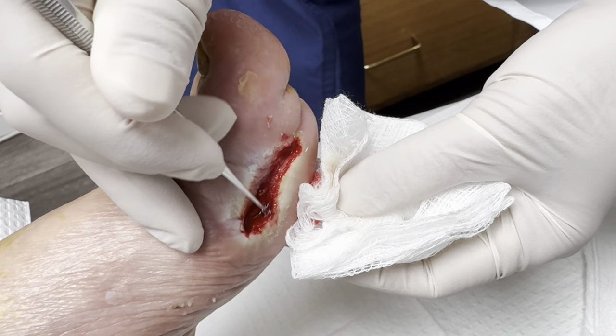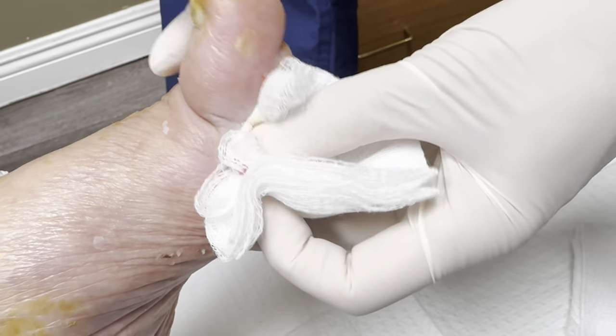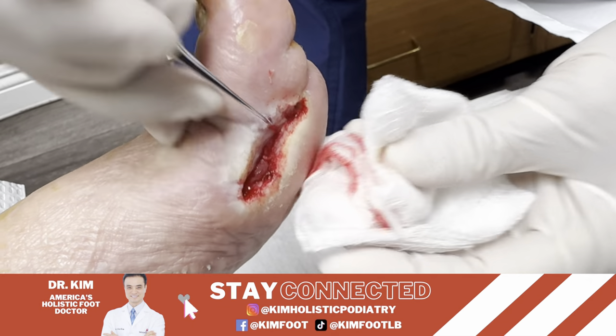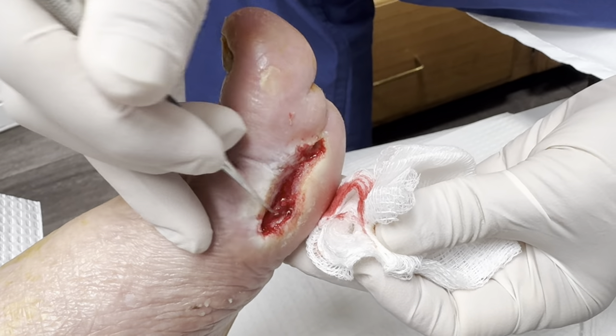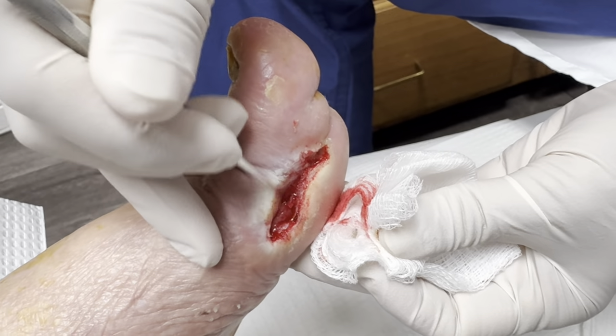So I'm just cleaning it up really good. You've got to make it bleed really well. She told me that her apartment was really hot and because of that she sweated a lot, and that's why it looks all wet around it. It's important to keep this area dry. She bleeds well though — she bleeds really well, so it's a good sign.